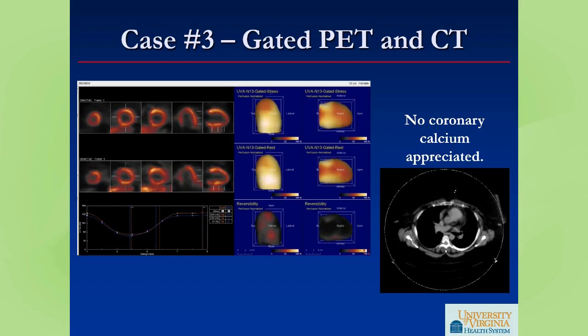And what you can see in the single shot, but also through a full review of the entire CT, is that there was no coronary calcium appreciated. And so certainly that's a step in the right direction.